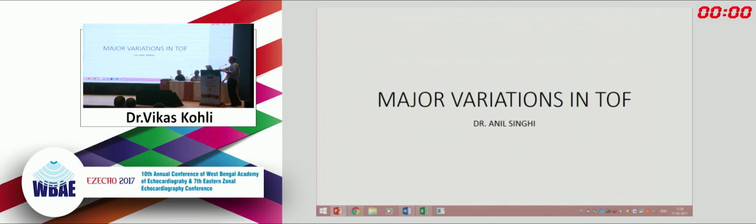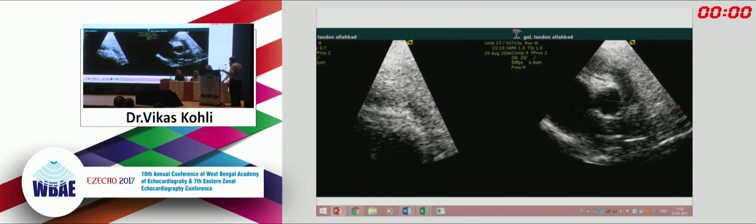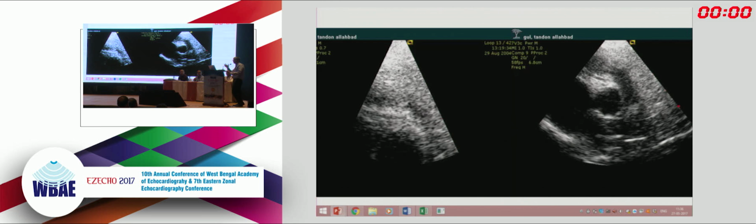And I'd like to mention a few things about the coronary artery anatomy, why its assessment is so important. If a transannular patch has to be put, that's exactly where the coronary artery is crossing the outflow tract. And if it's crossing the outflow tract and the surgeon is not aware or experienced, incising the coronary artery will result in an outcome where the patient may not go home at all. So if one makes the surgeon aware that there's a coronary artery crossing, he's going to be careful in the area where he has to do the transannular patch. And that is why the coronary artery anatomy is very critical.